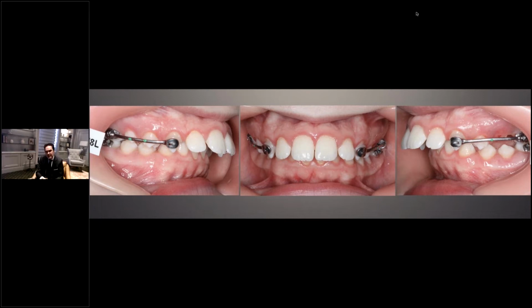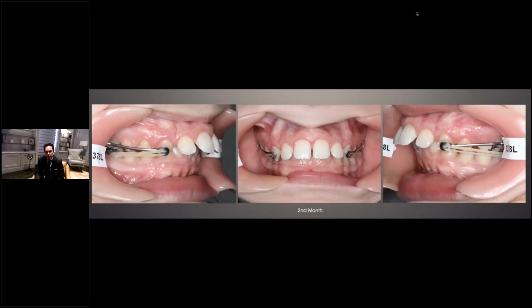Same-day start means it's a patient who comes for the first appointment, first time visit, and on the same day the patient comes, we start the treatment. So we do the records, we do all the necessary exams, and at the same time, on the same day, we place the motion appliance, we place molar tubes, and on the next day, we send the vacuum invisible retainer to the patient's home, right? Or with UPS or any courier.